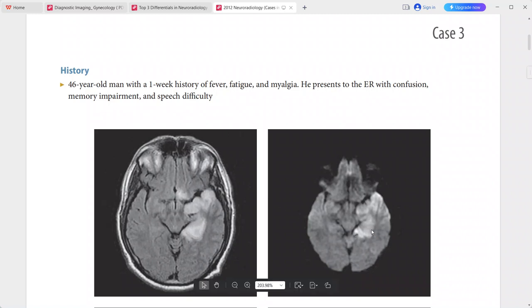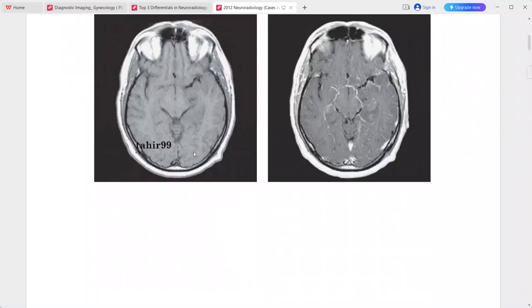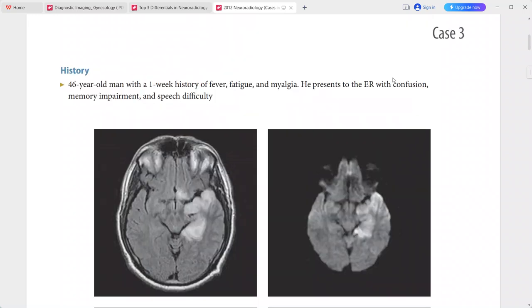The DWI sequence is hyperintense in these areas as well. On the post-contrast sequence, there is very subtle cortical enhancement. This is a case of herpes encephalitis. Other differentials include other viral encephalitis, limbic encephalitis, cerebral infarction, glioneuronal tumor, and seizure edema in status epilepticus.